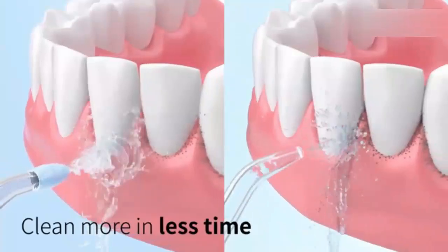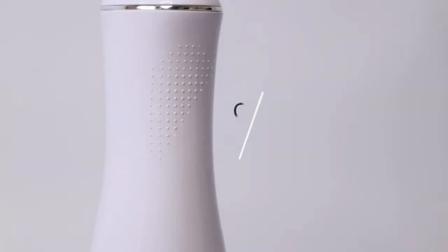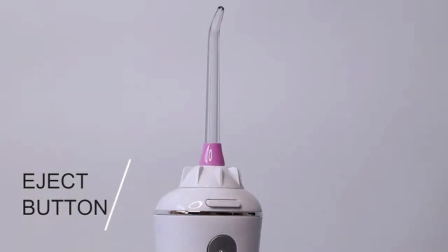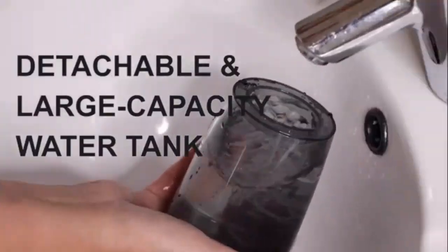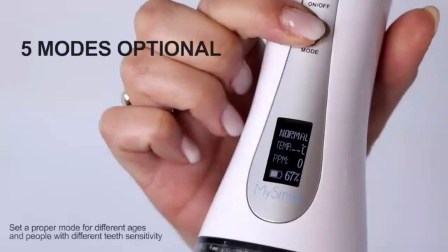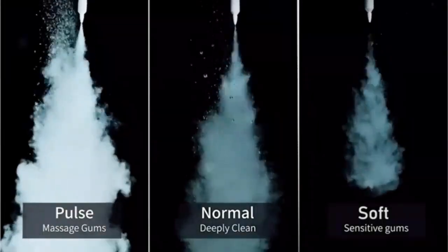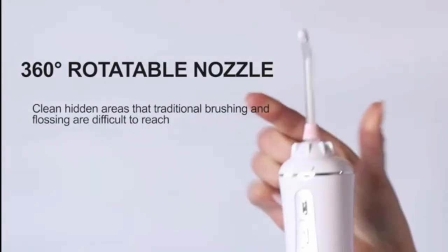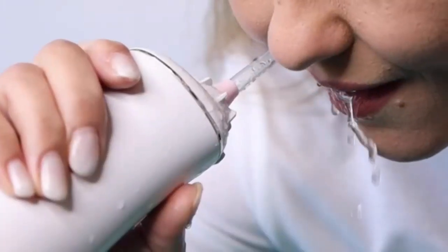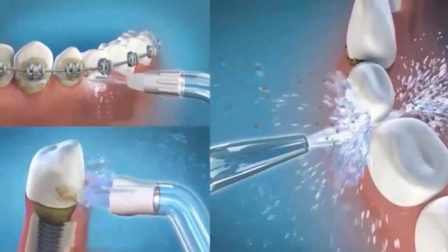Upgrade your oral care routine with the Bitvay C5 Water Dental Flosser — a powerful, cordless solution for healthier teeth and gums. This water flosser features advanced pressure settings, delivering deep cleaning between teeth and along the gum line where traditional brushing can't reach. With its ergonomic design and long-lasting battery, it's perfect for use at home or on the go. The flosser's compact size makes it travel-friendly, while the EasyFill water tank ensures hassle-free operation. Ideal for anyone with braces, implants, or those seeking a superior clean. Achieve a dentist-level clean at the press of a button.